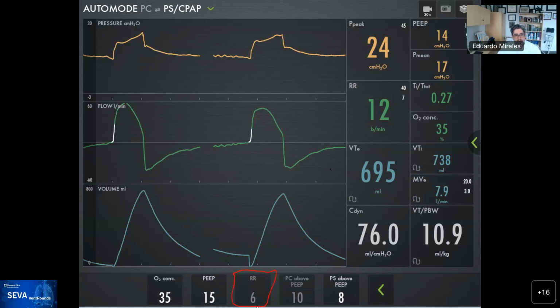If you are on pressure support and somebody comes and sees that there's an apnea alarm and the patient goes for 20 seconds, 30 seconds, then they will switch them back to a rate, which will end up in the same behavior. And so it's a challenging situation at the bedside that unless somebody is aware of it, it doesn't work.